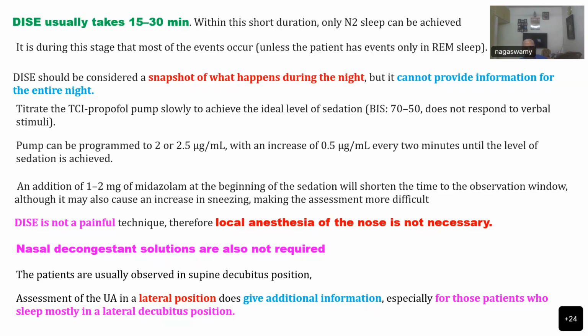So they adapt themselves to either semi-prone or full prone also, because the airway becomes larger in those positions. So you can do it in the lateral position also.